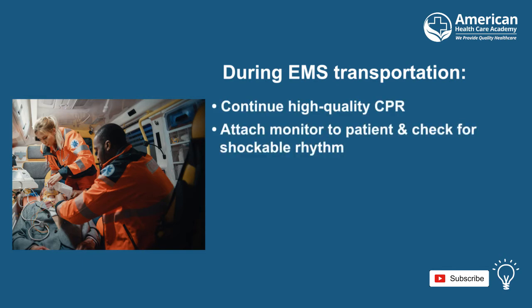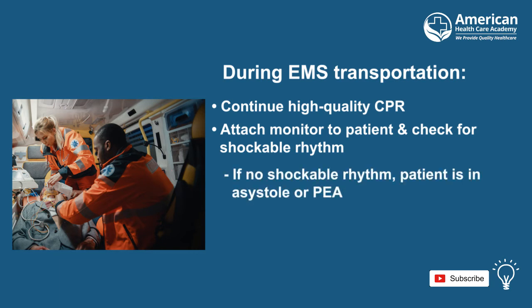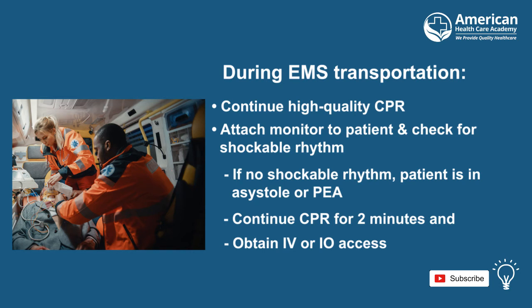Next, attach a monitor to the patient and check for a shockable rhythm. And if no shockable rhythm is present, that means that the patient is in asystole or PEA. Continue CPR for 2 minutes and obtain IV or IO access.